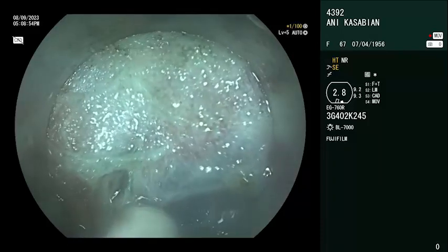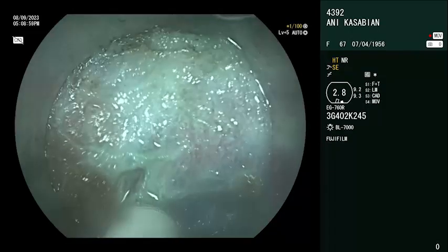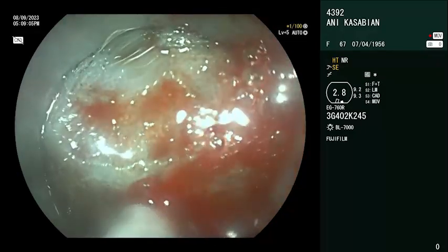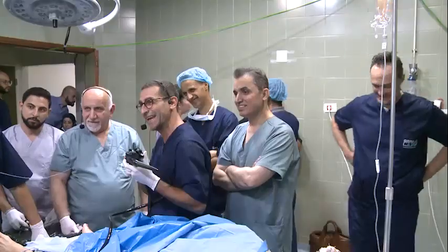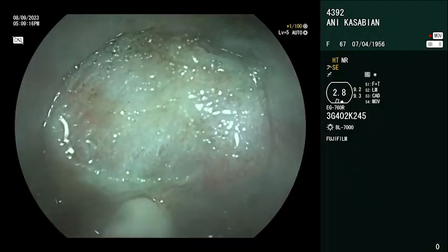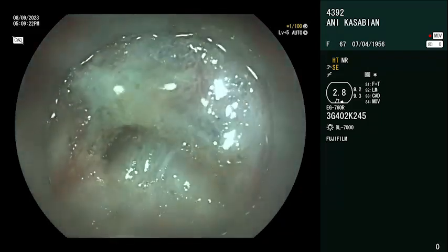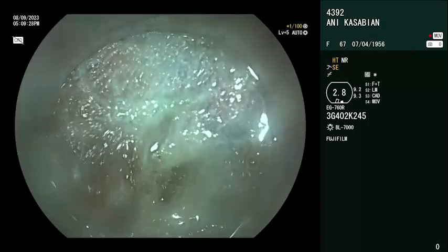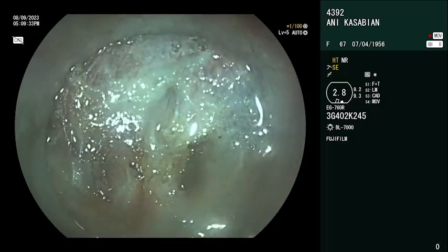Okay, I switch, soft. Okay, forced. It's really tricky. I have to stop to say okay, as Marc says. Perhaps I have to take the coag grasper. No, okay, no need. Perfect. And sometimes it's more difficult to see the vessel when you have a fibrotic area.